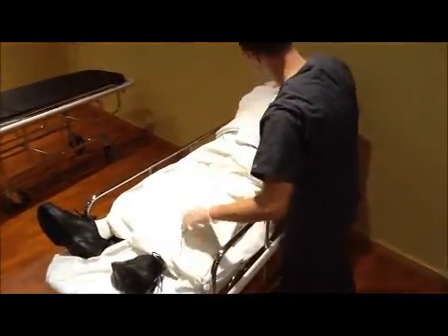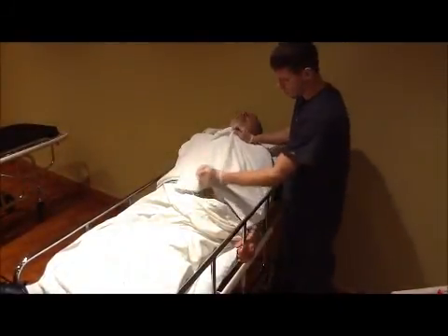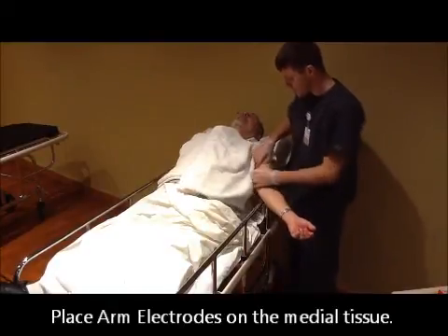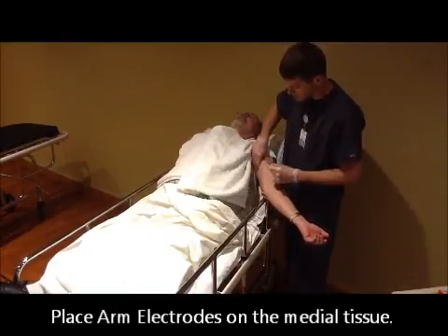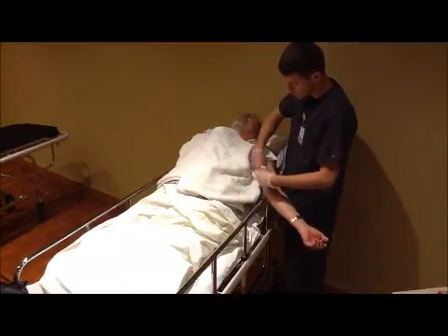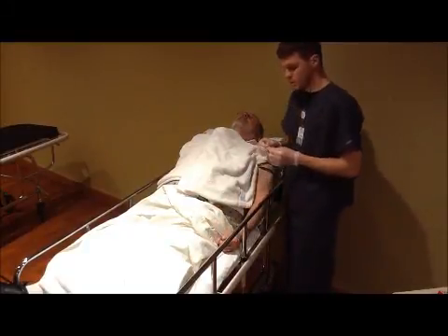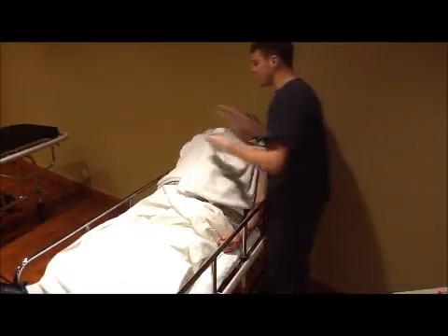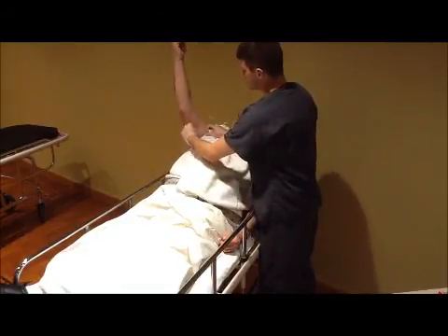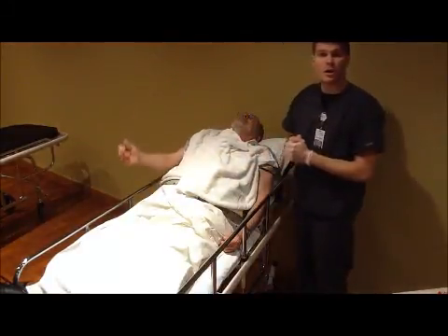The last two electrodes go on the arms. Go ahead and lift your arm up, sir. Place them on the medial side, on the tissue — not on bone, because bone is not a good conductor. We'll put one on each arm. Once all ten electrodes are placed, you're ready to attach your leads.